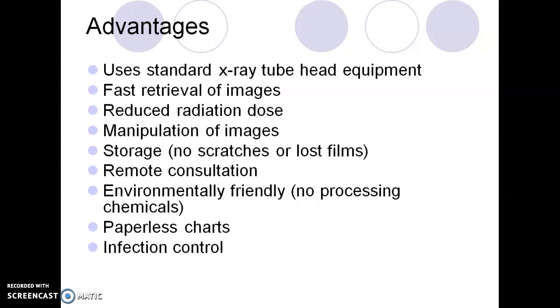A lot of offices have gone paperless, and so if you have a paperless chart office, then you would want digital radiographs. Otherwise, you've still got a chart with just the radiographs in it. A lot of offices converting from traditional paper to paperless will have a period of time where they either have digital radiographs but not charts, or the other way around, where they have digital charts and they keep radiographs in a folder with the patient's name. So once that transitions over, typically that goes away.